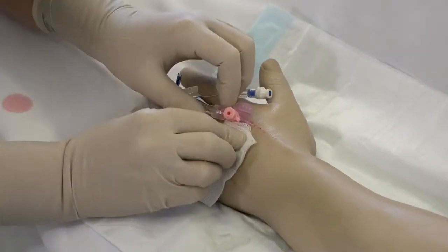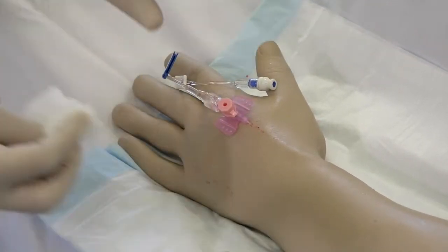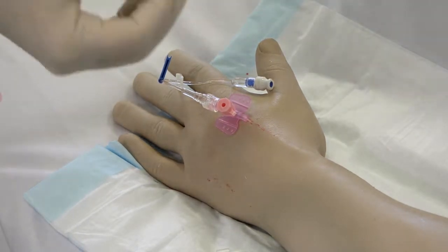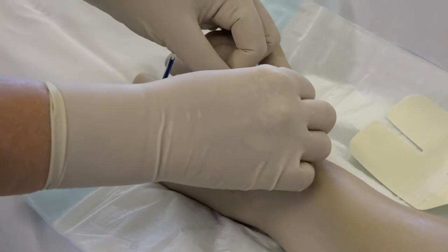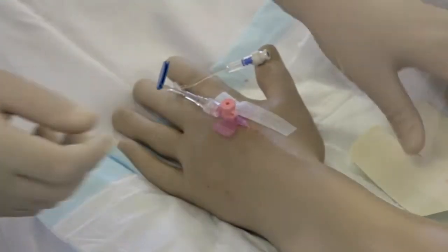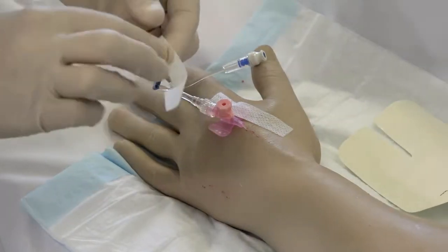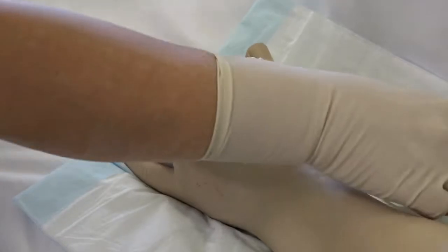Clean up any spills. Apply the semi-permeable dressing and secure the cannula to ensure it is safe and secure.